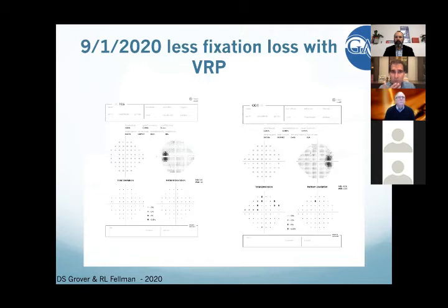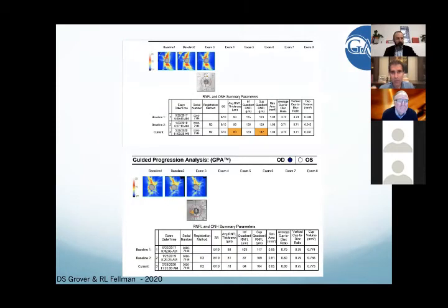Now you look at her visual field that we did in September of this year. She had fewer fixation losses, right? Much more reliable, and the left visual field is normal. But if you look at the right, the grayscale shows possibly some decreased contrast sensitivity up top, but if you look at the total deviation, even the pattern deviation, you see a defect that is very classic for nerve fiber layer loss.